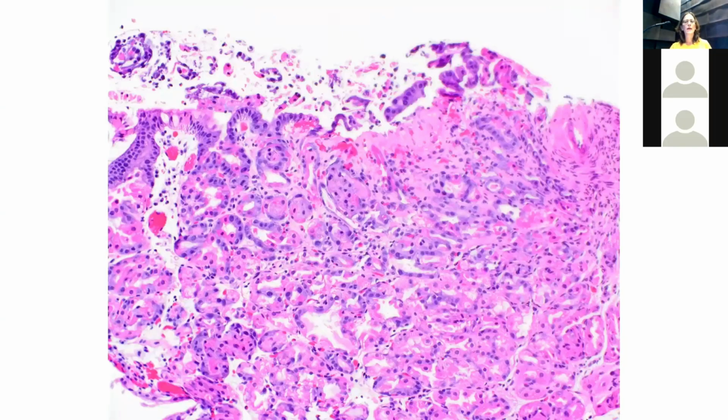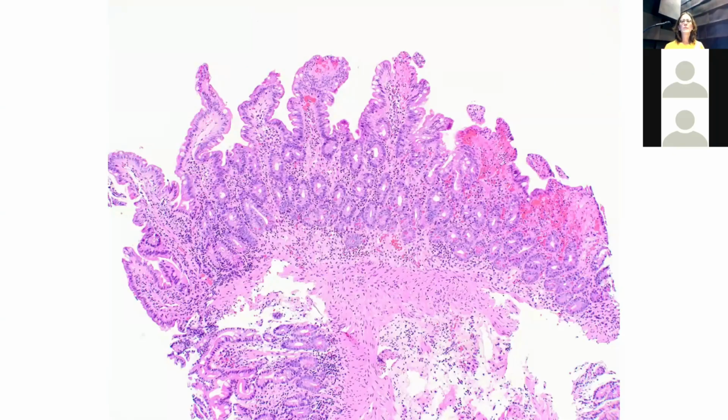All right, so I got this biopsy from the patient's gastric body. And I noticed that it had an erosion, and I noticed, oh gosh, these parietal cells are kind of high, but oh, come on, patient couldn't possibly have anything. So I was kind of concerned. And then I got the patient's duodenal biopsy, and there was also an erosion there, and it looks kind of, what's the right word? Reactive. It doesn't look very happy.